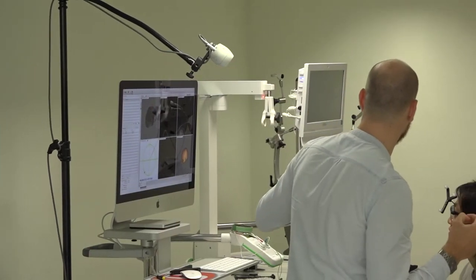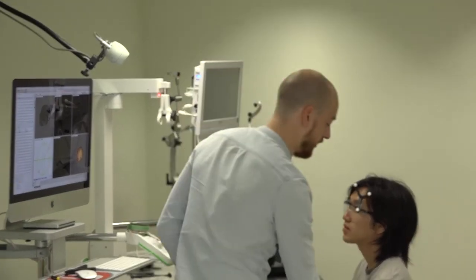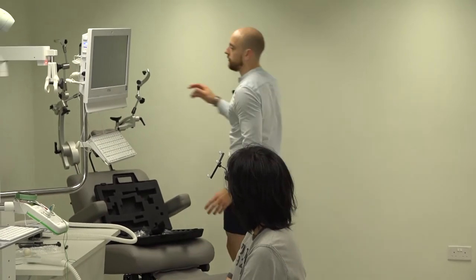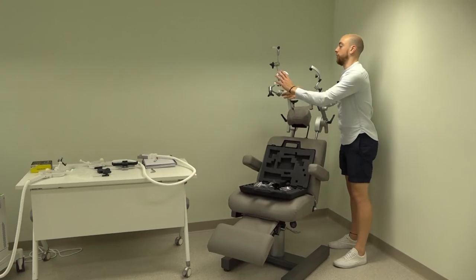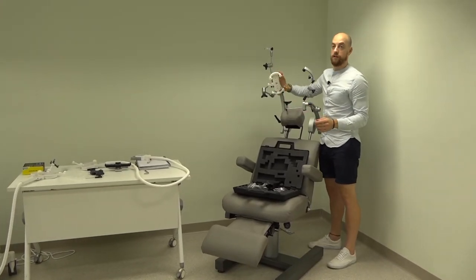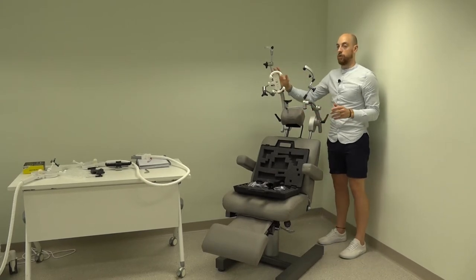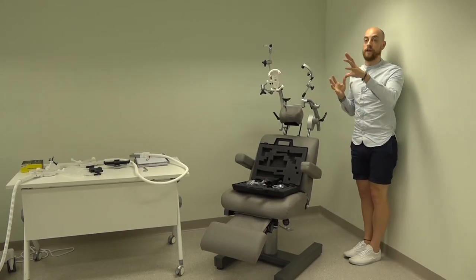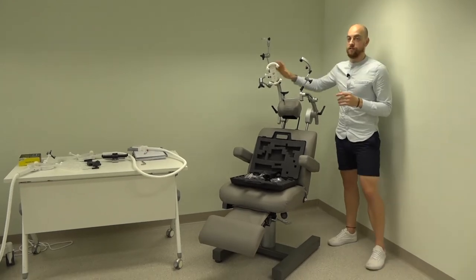So we ran over that this morning. What we'd have is the chair here instead of the green chair, and we'd have a coil. This here would be holding the coil. BrainSight has a coil tracker on the back of this as well, so BrainSight knows exactly where this coil is and exactly where the chair is. As we're stimulating, this is all held nice and still. We've got our subject still. It takes away that human error. When I was struggling to orientate the coil there, the chair helps us take away that error.